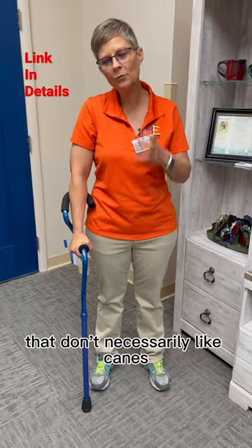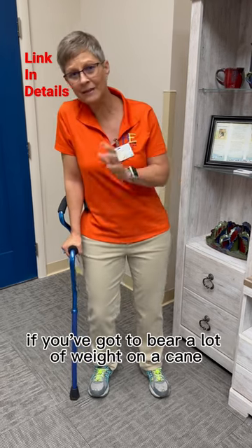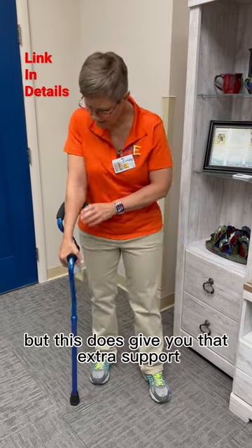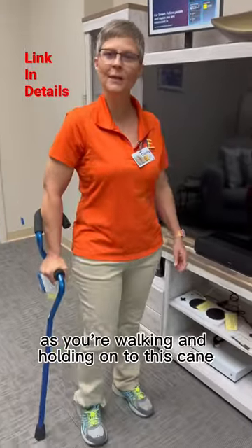There are a lot of my clients that don't necessarily like canes — they don't think that they're enough support. Now, I'll just reiterate: if you've got to bear a lot of weight on a cane, you're probably not ready for a cane. But this does give you that extra support and a little bit of extra stability as you're walking and holding on to this cane.